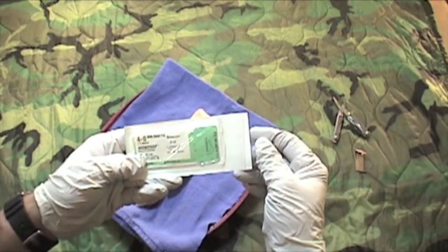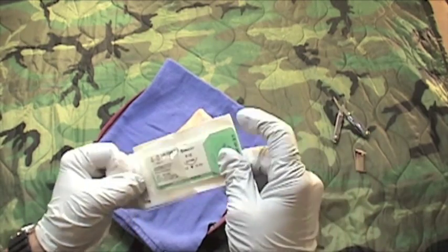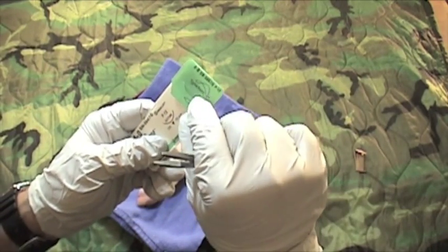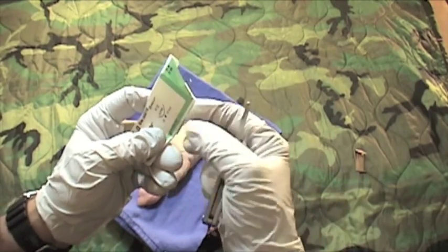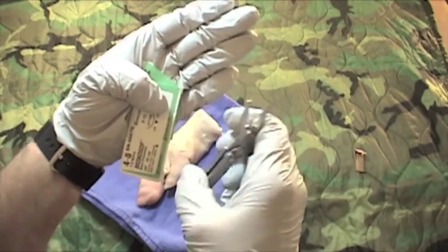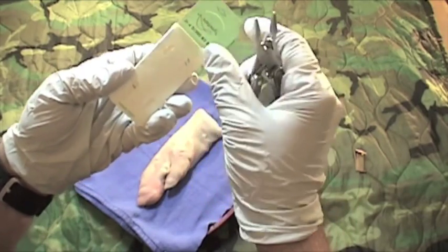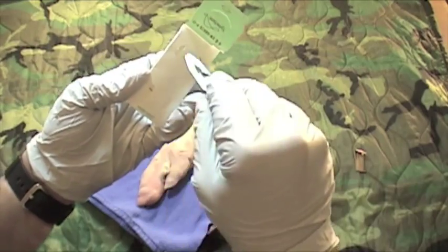Let's open up our suture pack. These just peel open, and you see this little arrow — you just peel this back. You'll see there's the needle and there's the suture material. If you look inside here, the suture material is wound up inside this envelope as a storage container.